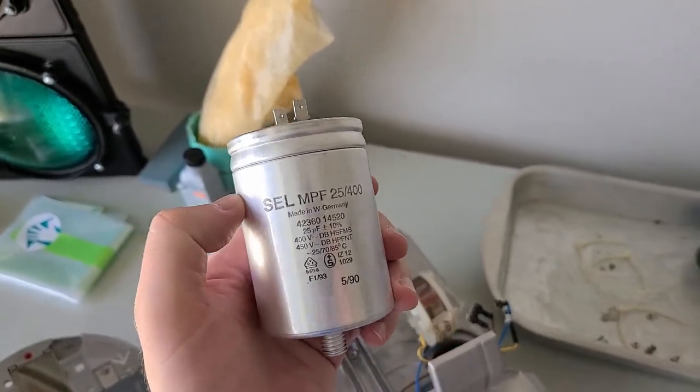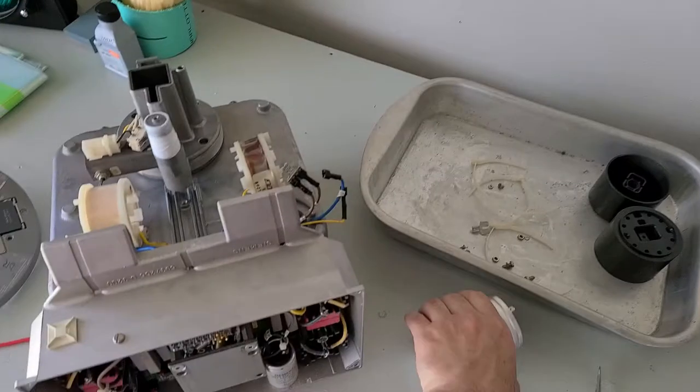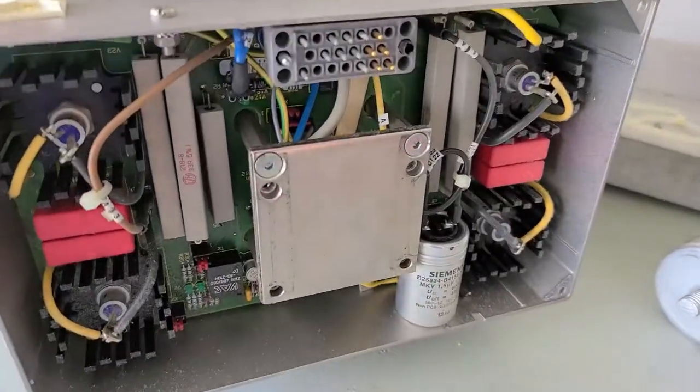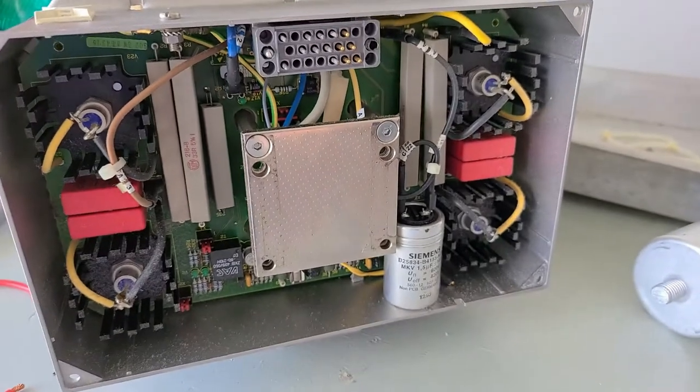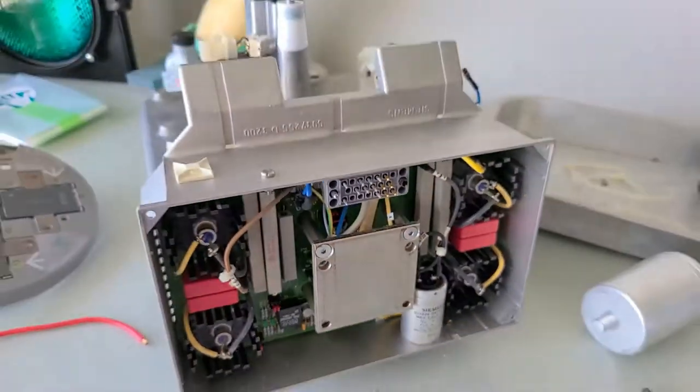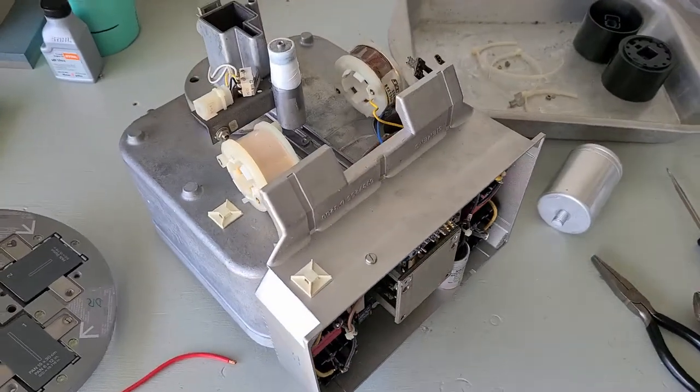It is, you know, 400 some volts. And it could give you quite a shock. And then I took off the metal plate that was right here in front of the circuit board. Pretty neat thing. I'm going to go ahead and take it apart a little bit more before I get to the main housing.